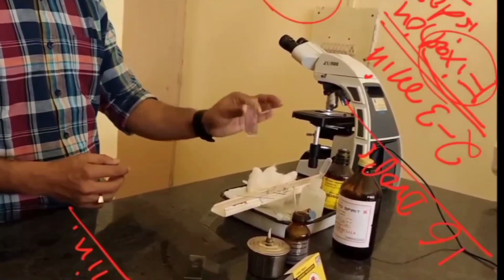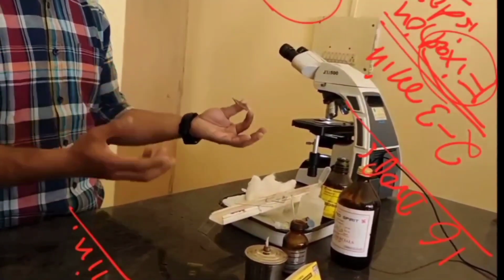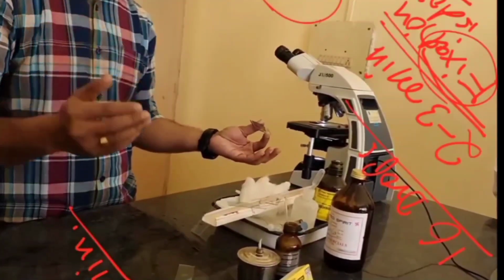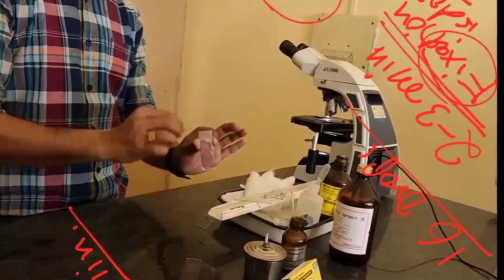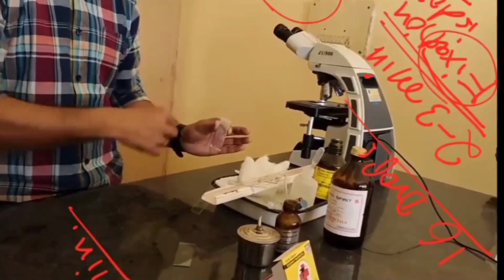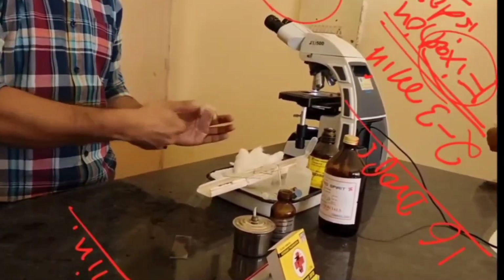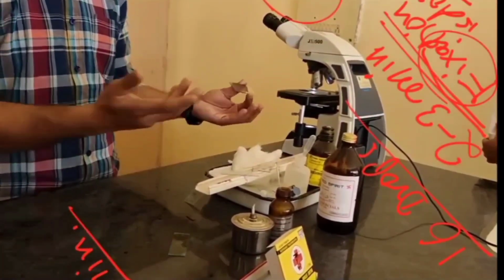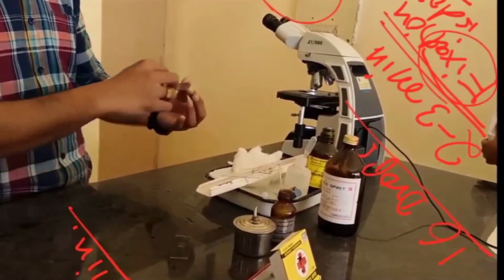This slide is already dried completely, and I am going to use this slide to see under the microscope. First I will focus on the screen at low power, then high power, and then finally I will count it under the oil immersion, which is the 100x objective lens. So 100 into 10, total magnification will be 1000.